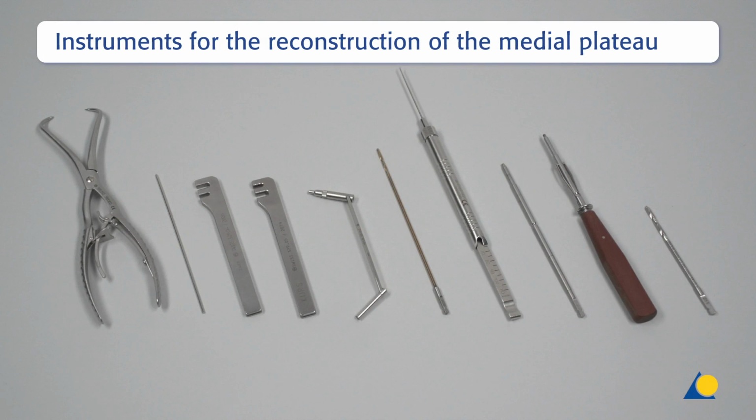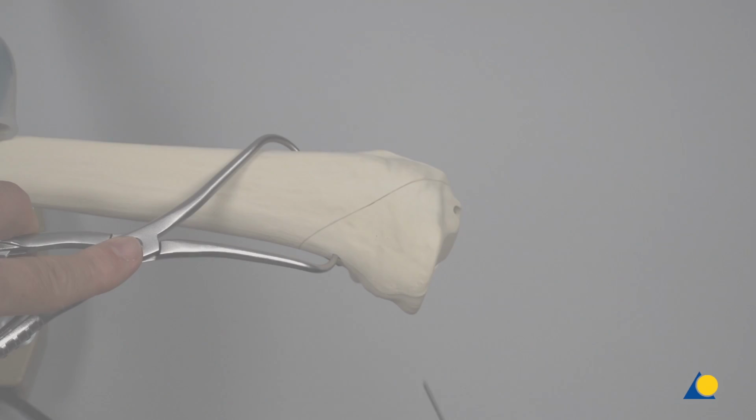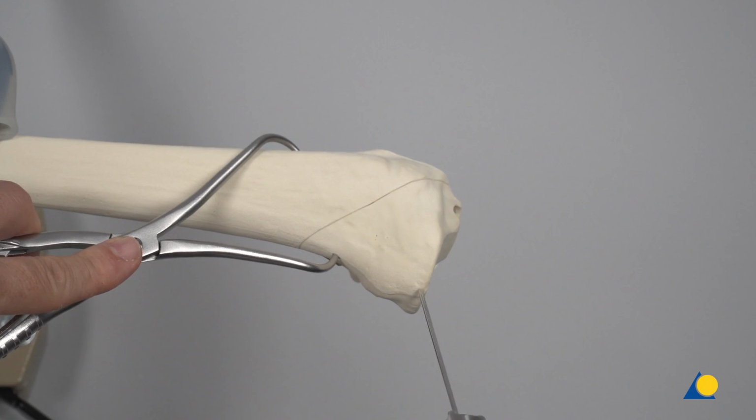The instruments required for the reconstruction of the medial plateau include the reduction forceps, the K-wires 2.0 mm, the bending irons for plates, the universal drill guide 2.5/3.5, the drill bit diameter 2.5 mm, the depth gauge for long screws diameter 3.5 mm, the hexagonal screwdriver shaft diameter 2.5 mm, the hexagonal screwdriver diameter 2.5 mm, and the drill bit diameter 3.5 mm.